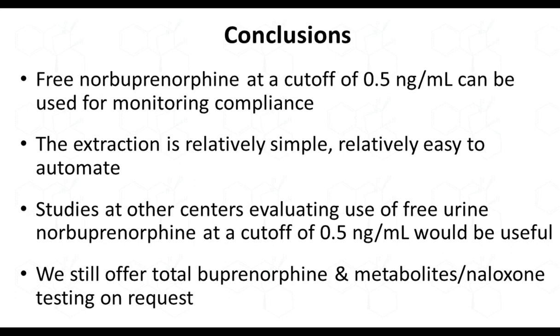There's such a burden for doing method validation and development. I don't know that many sites would want to replace their current protocol, but if you're new to this type of testing, I would encourage you to think about whether this might be suitable for you. It may require some additional consultation with your clinician so that they understand if they've been getting testing, say, with total, and now you're switching to free, but that's always a productive conversation to have anyway, regardless of what method you'll be testing with. It sounds a little pretentious, the title of a new paradigm.